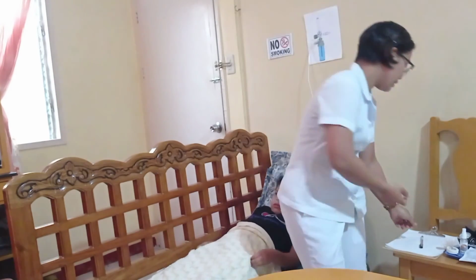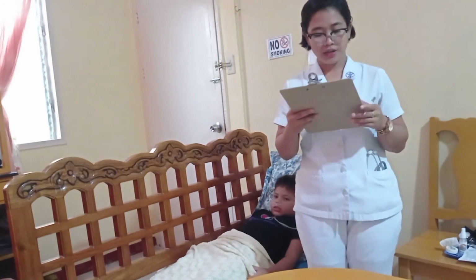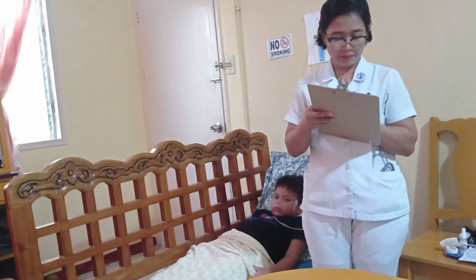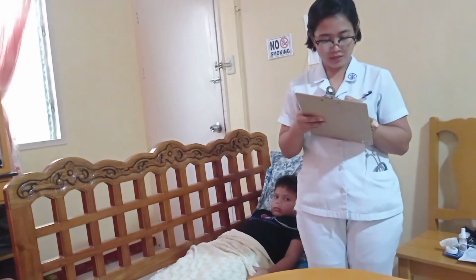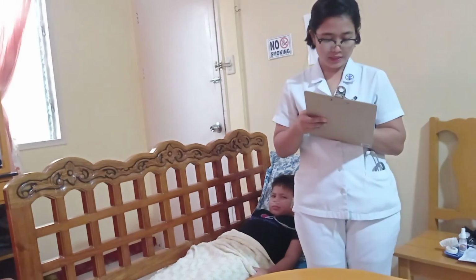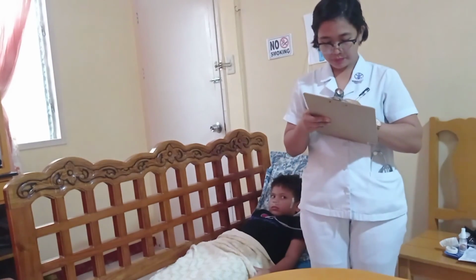So, I have here the respiratory rate of our patient at 18 CPM, and the vital signs of SO2, oxygen saturation at 86, with beats per minute.